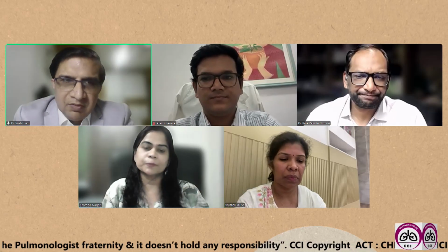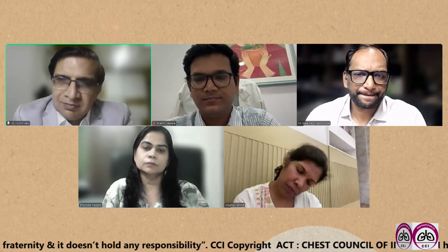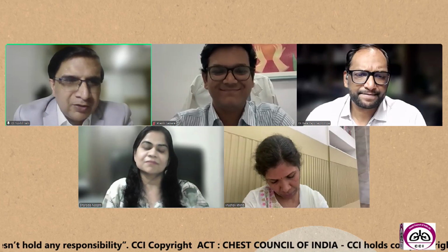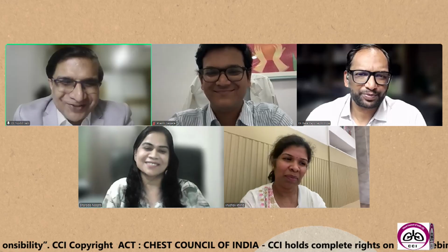I agree with you because most of the pathologists are not well trained for EBUS TBNA. I remember Dr. Anita Burgess, to whom I had a chance to send samples. She used to always say, send bigger tissues. She was always like, why are you sending such small tissues?